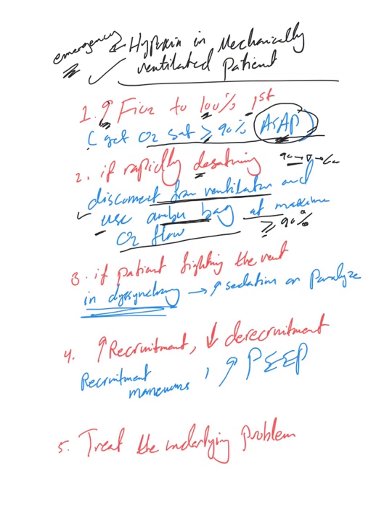And once we bring it up there, we can reconnect him to the ventilator and then try to check what's going on. If the patient is fighting the ventilator, that means he or she is in desynchrony. The fastest way is to increase sedation or paralyze the patient. That can fix the issue and give us some time to find out why the desynchrony happened and fix it. And again, these are temporizing measures. You need to get patients off paralytics as soon as possible, and you need to get rid of deep sedation as soon as possible.